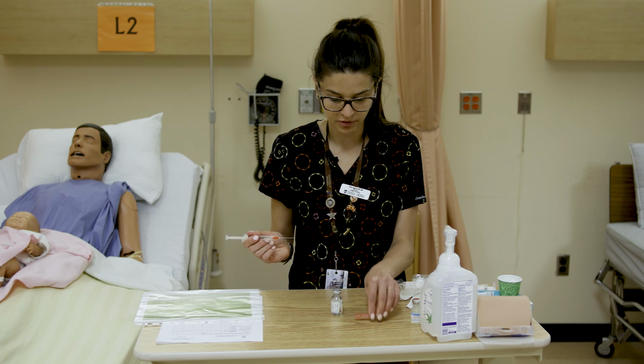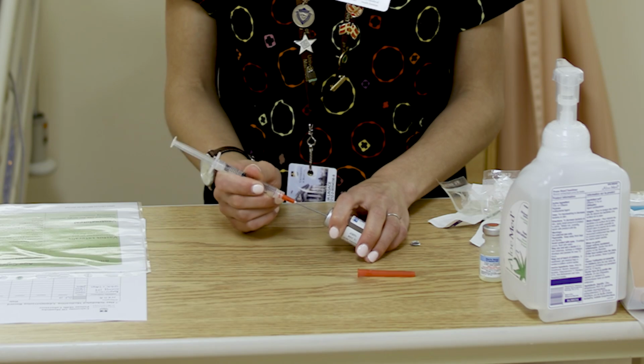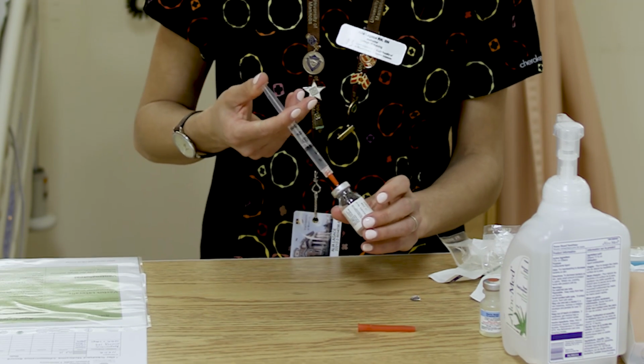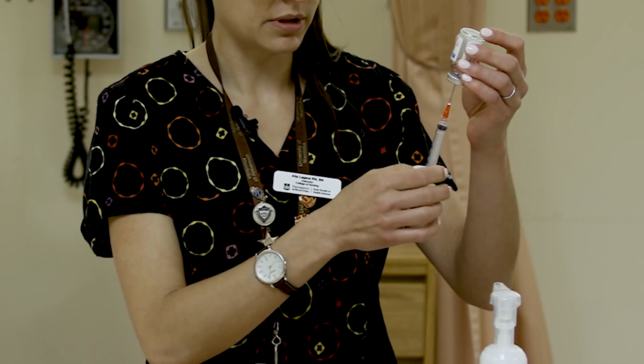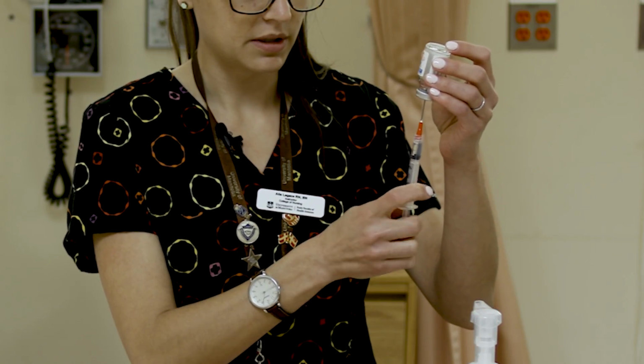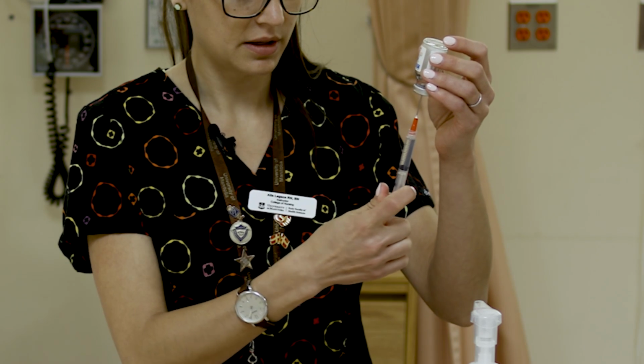So we're going to remove our cap, I'm going to stabilize and try to inject right at the center again. And we're going to instill that air, flip it, and we're going to let it come out. And we might just have to help it along again.